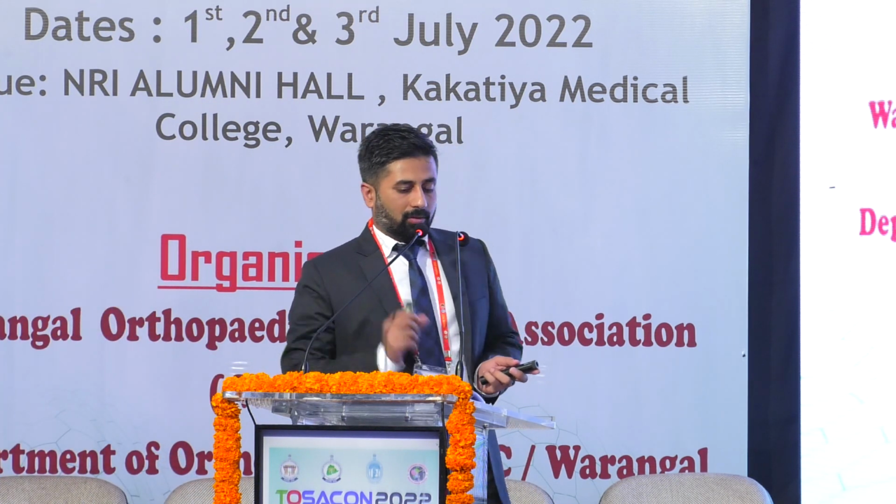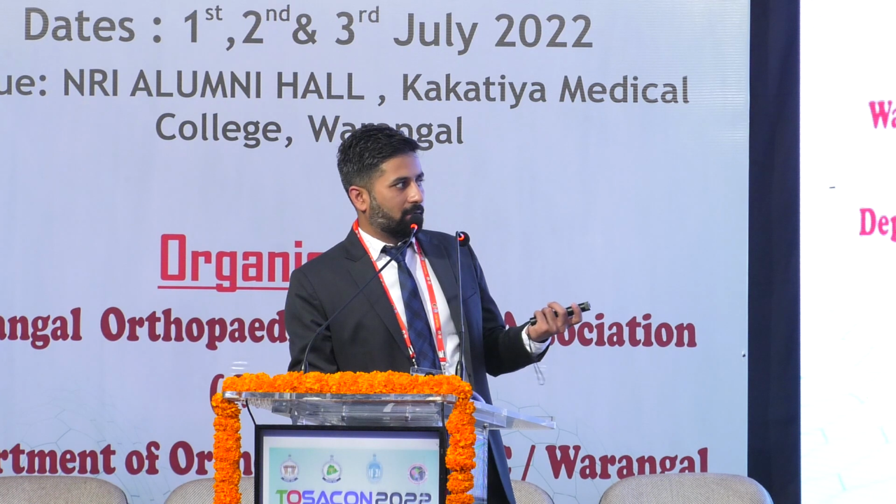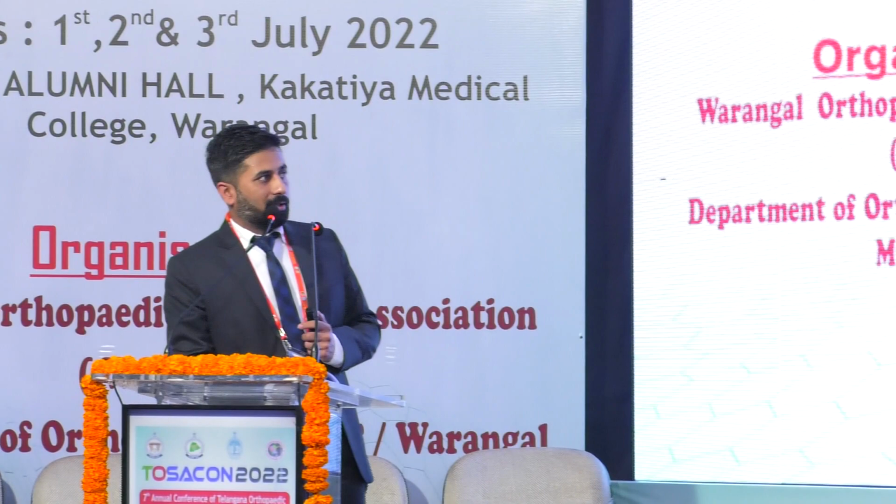So these were her initial X-rays. If we can see here, the trapezium is fractured. So considering this X-ray, there are multiple options available. We can do a percutaneous K-wire fixation, or we can put a headless screw. So the operating surgeon who was operating on her put these screws, and after 1.5 years, they removed the screws, and after that the patient came to us.